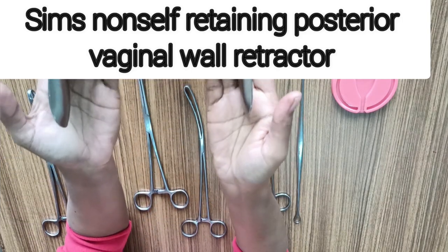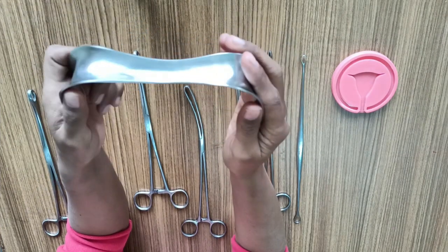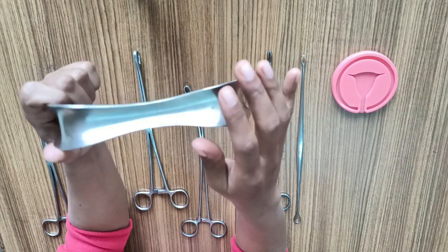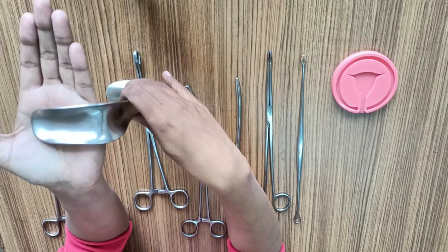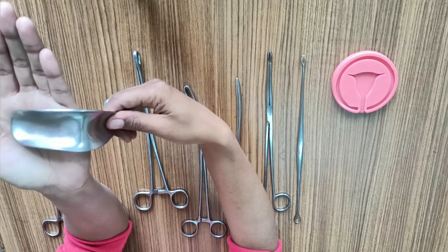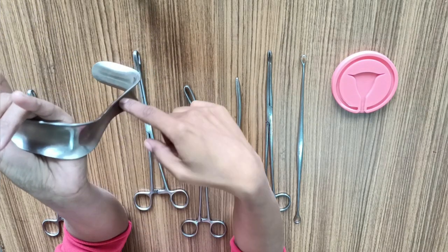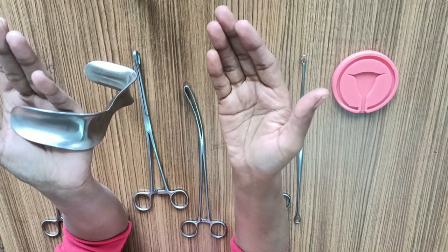The next instrument is a Sims speculum, or Sims non-self-retaining posterior vaginal wall retractor. It is double-plated with blades at right angles connected in the middle by the shaft. This is for retracting the posterior wall of the vagina. It is available in different sizes, and in the middle we have a trough or groove so that contents obtained from the procedure can be collected or excess products drained through it into the bucket.